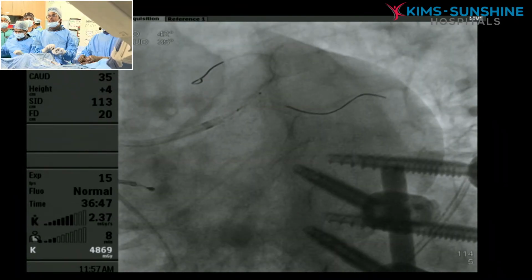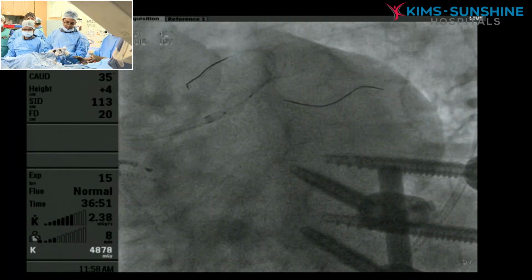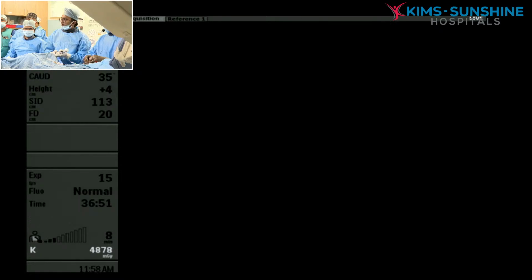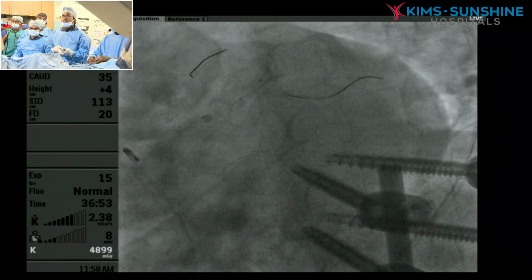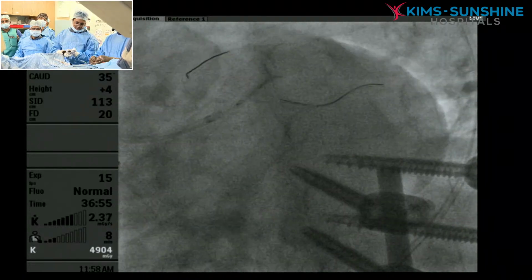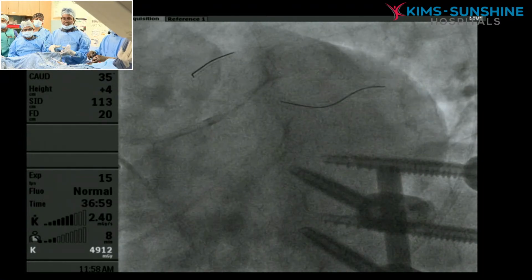That's enough. It's going, కదా. Dilate here also. Redilate higher, 18, these 2, 18 20 deflate, come out, give me that 3 balloon.